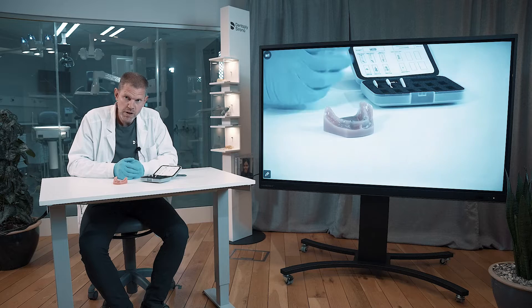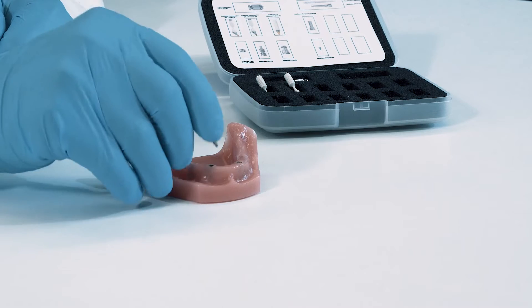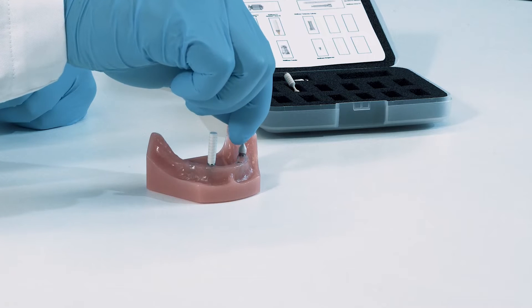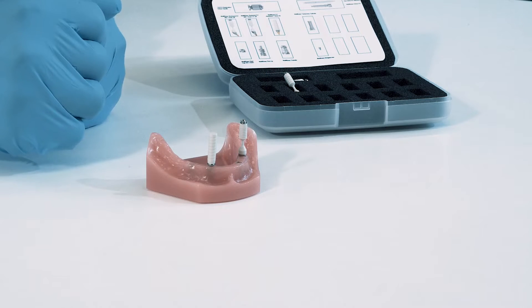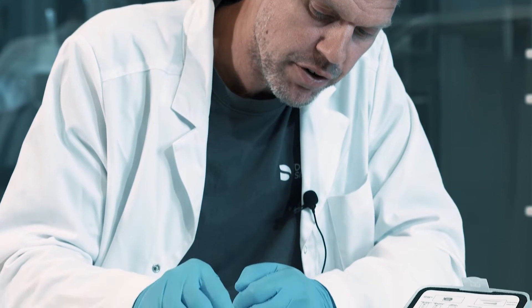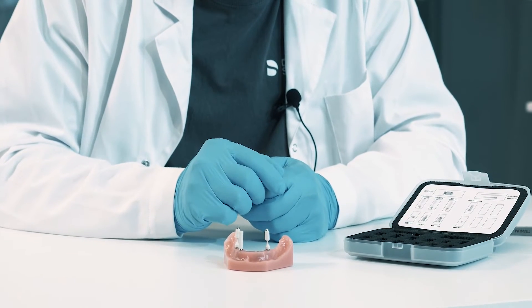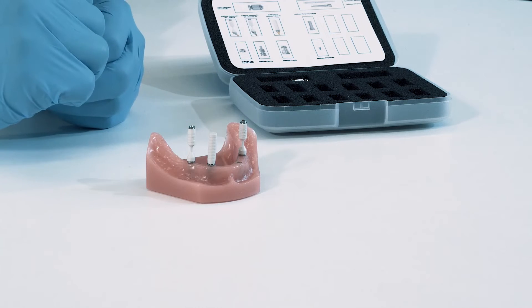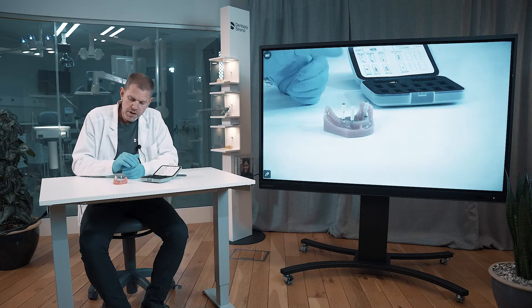We have three different multi-base abutments. One straight that should be placed in the anterior part of the model. We have one 30-degree indexed that I recommend to be placed in the posterior 3-6 position. And we have a 17-degree non-indexed that should be placed in the posterior 4-6 position. As you can see, we have parallel abutment direction, so it's easy for the next coming superstructure to be fitted onto the abutments.